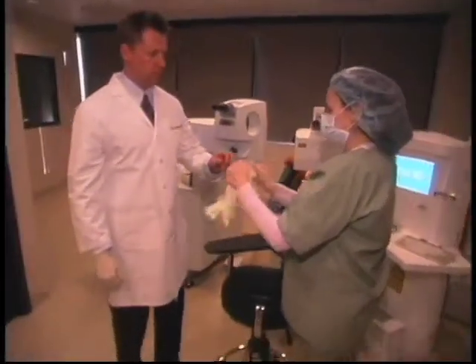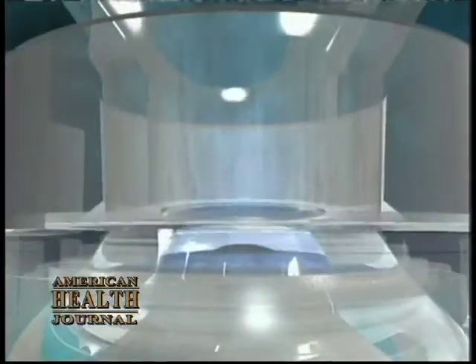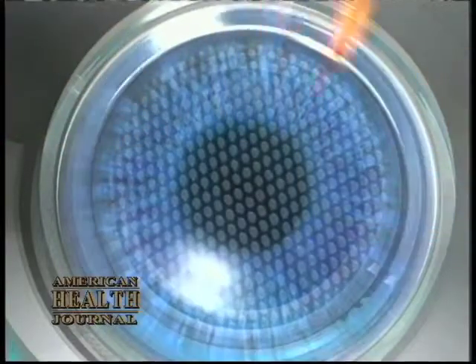LASIK is a procedure in which we modify the shape of the cornea to correct any underlying refractive errors that you may have. And by refractive errors, we mean nearsightedness, farsightedness, or astigmatism. Now, LASIK, by definition, involves the creation of two components. The first component is where we create the flap, what we call the IntraLase, which is an all-laser, bladeless approach to LASIK, in that the laser itself is actually able to create the flap.